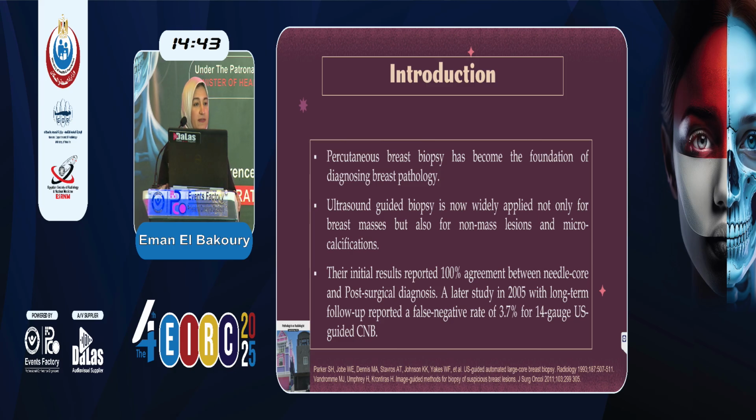We all know that currently the percutaneous biopsy has become the gold standard for evaluation of breast cancer preoperatively, and from it we will talk about the ultrasound-guided biopsy, which is currently, as said before, widely used. It's very common, easy for the patient, and available.